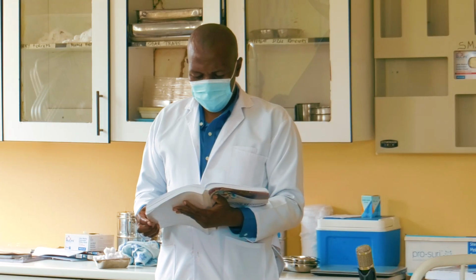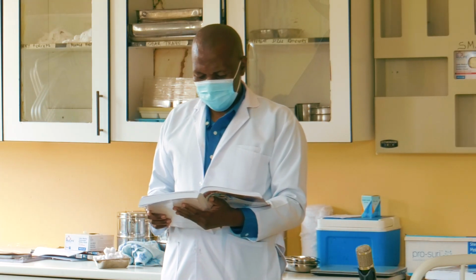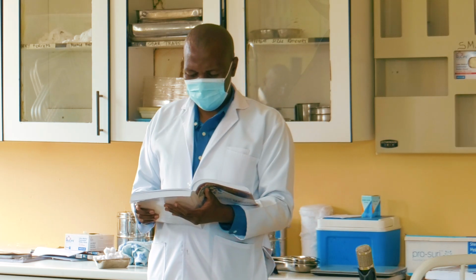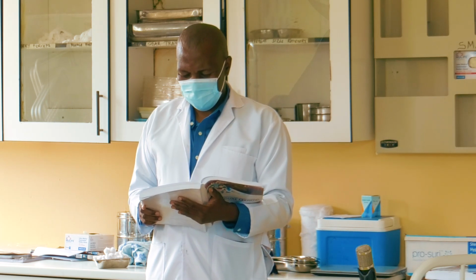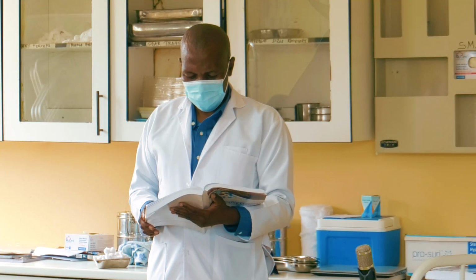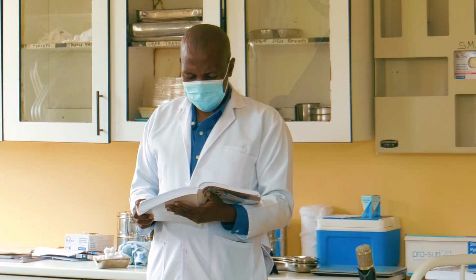What are the principles? Maintain aseptic technique during the procedure, use sterile equipment, ensure a clean environment. The dressing should completely cover and protect the wound. Minimize talking during the procedure.